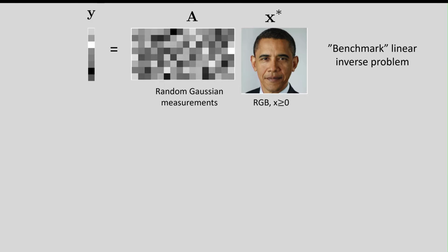So let's tailor it to the medical imaging domain. What's the problem? Well, when people design those generative models, they usually benchmark them on what I will call this benchmark inverse problem. It starts with a picture of a celebrity. Often it's Obama. Hope you all voted today.